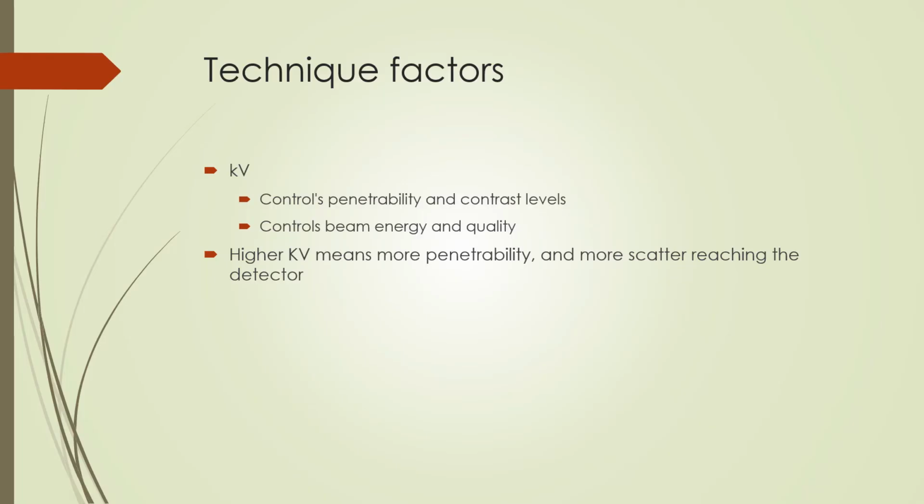After learning about X-ray generators, X-ray production, and the control of X-ray production, we can now learn about X-ray technique factors used for imaging. An X-ray technologist can select various technique factors for imaging at the X-ray console. A technique factor that is selectable at the console is the kV. kV controls the beam energy by controlling the kinetic energy of the electrons in the X-ray tube. kV also controls beam penetrability.